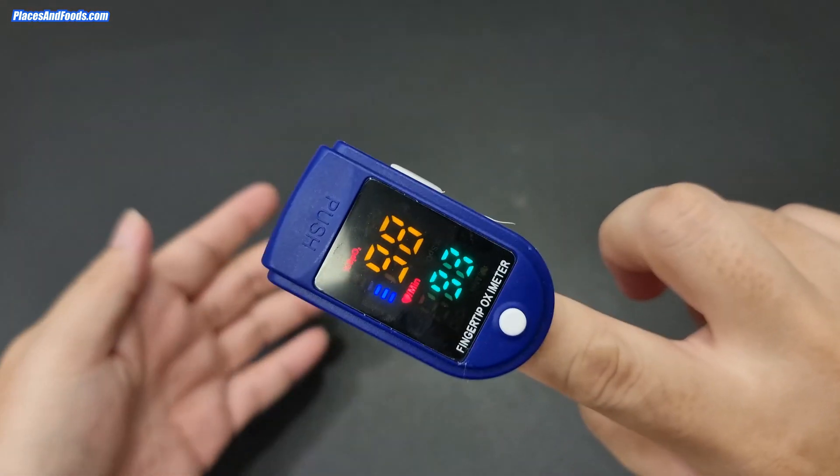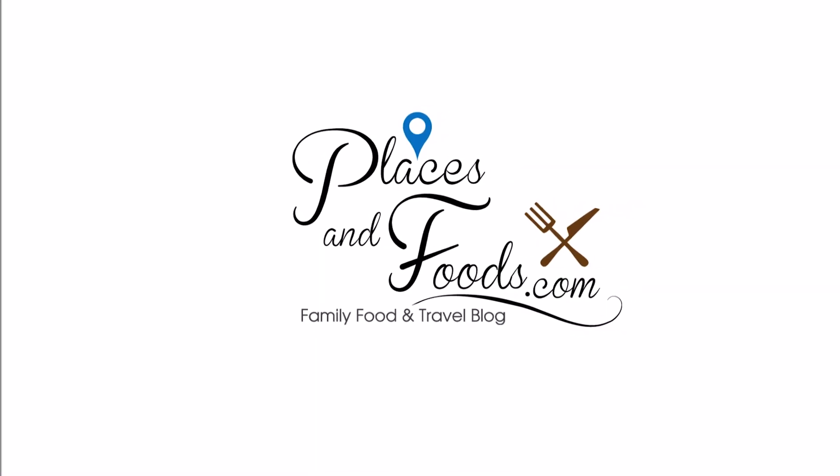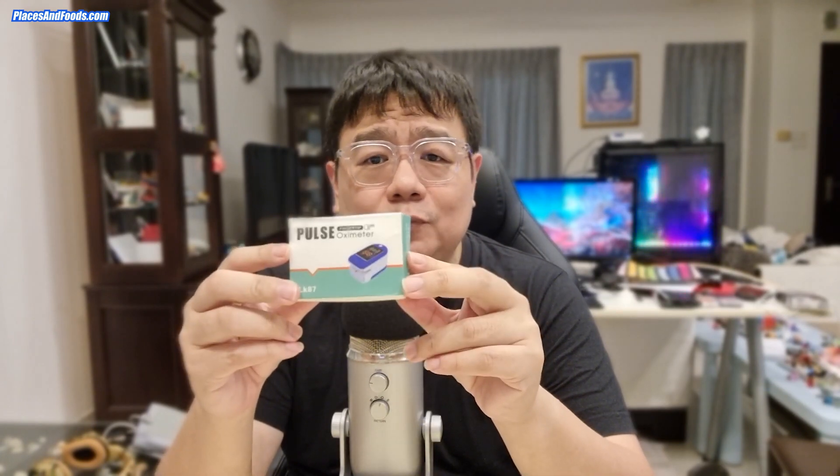Does this cheap pulse oximeter really work? Hi everyone, this is Wilson from Places and Foods. Today I'm going to talk about one of the popular devices people are buying right now — the oximeter. I want to show you two things: first, how the oximeter works, and second, does it really work properly.